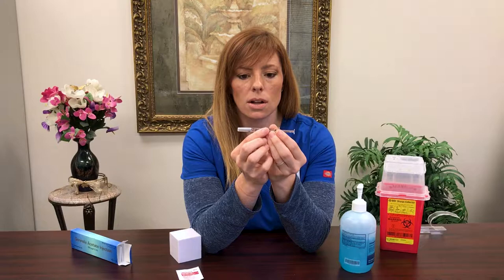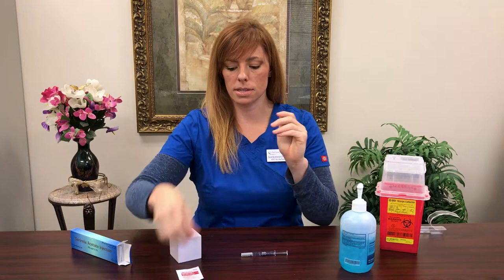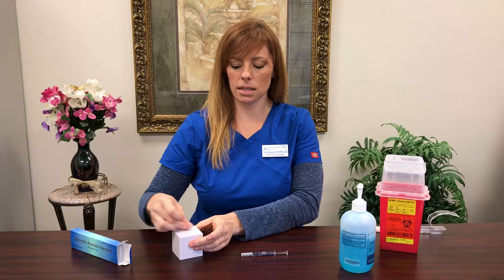First things first, all I need you to do is wash your hands. Prep your skin with your alcohol wipe — 10 seconds on the belly. Let that air dry; no wafting or waving.